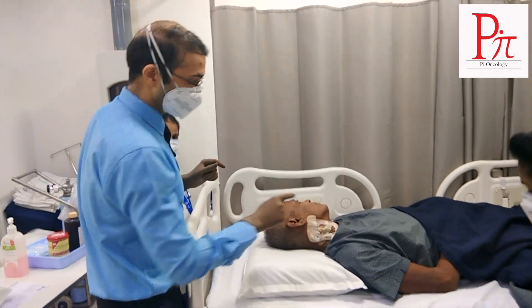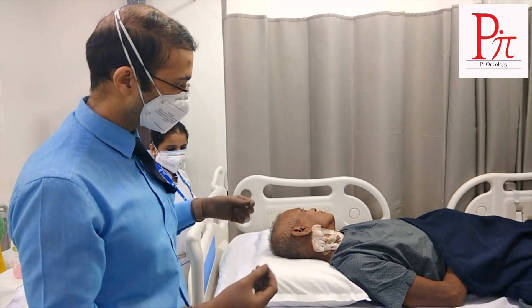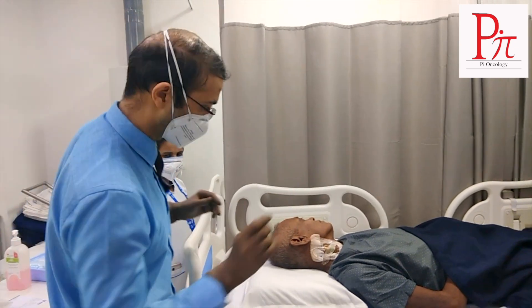So after this, removal of centerline is much more easier. You will see, we have to just remove the dressing, cut the suture cords and then remove it, keeping a pressure.